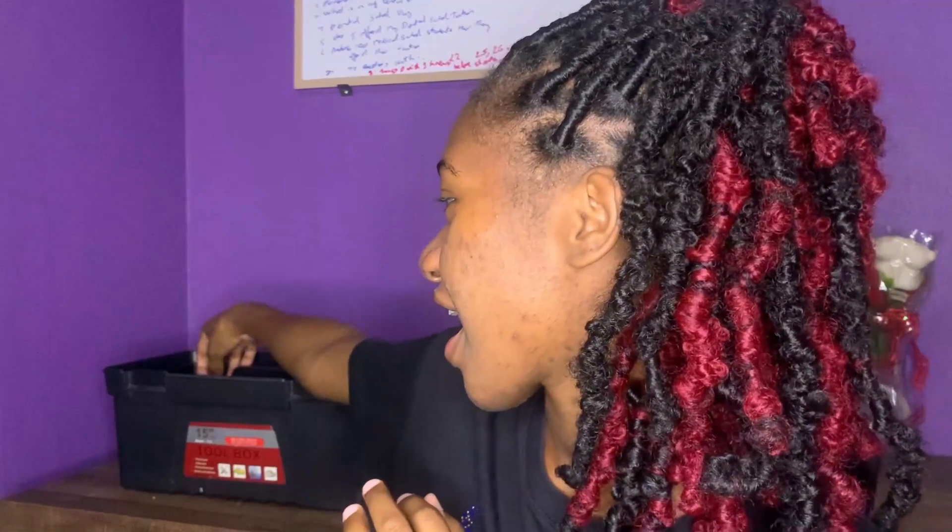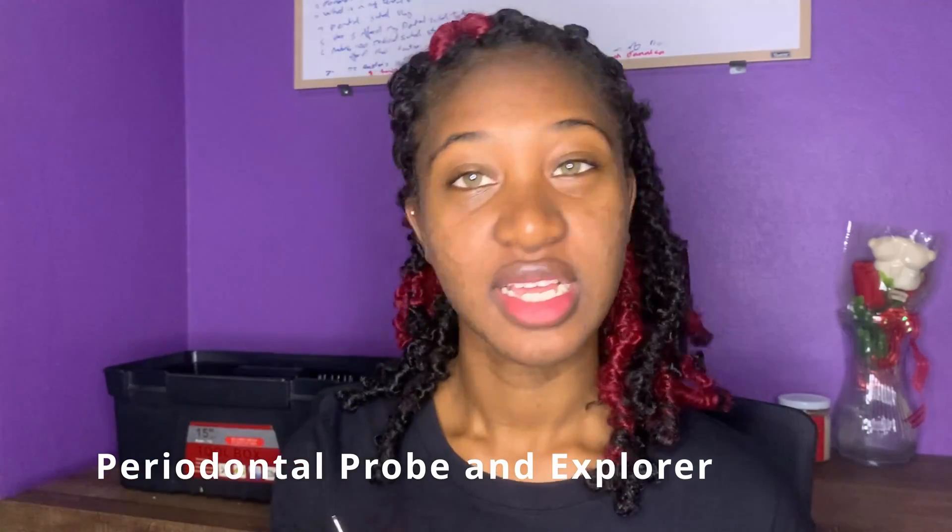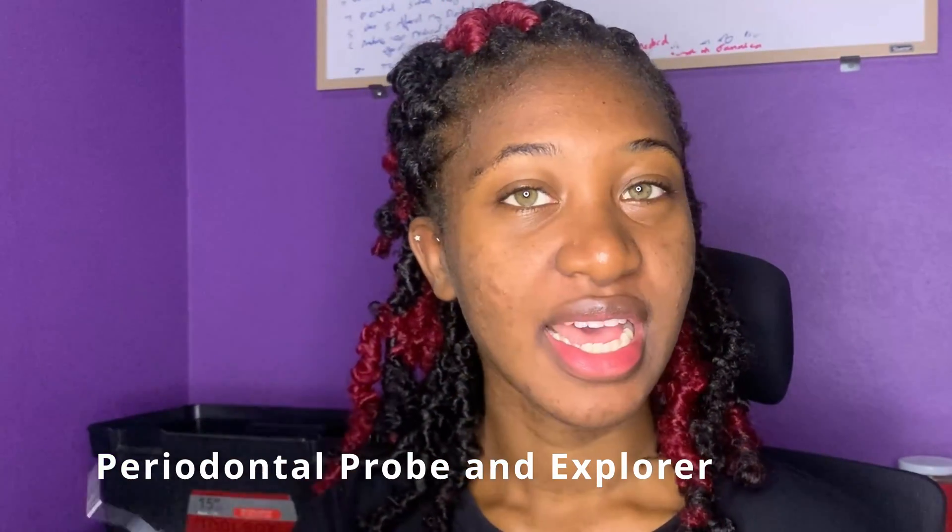The first instrument I have is my probe. This end is the probe and this end is the explorer. This is part of the basic setup, and as a first-year student you're going to need this. You're gonna need a probe to take your measurements and you're gonna need the explorer.